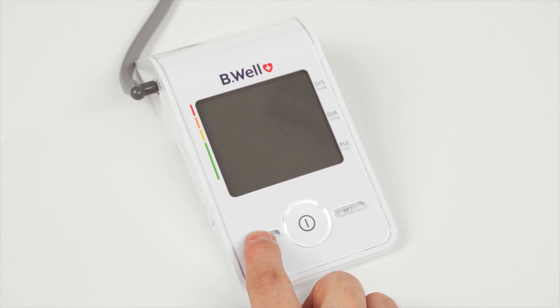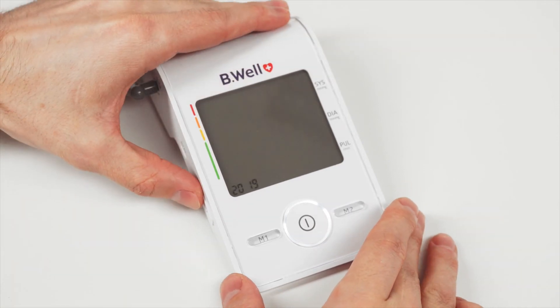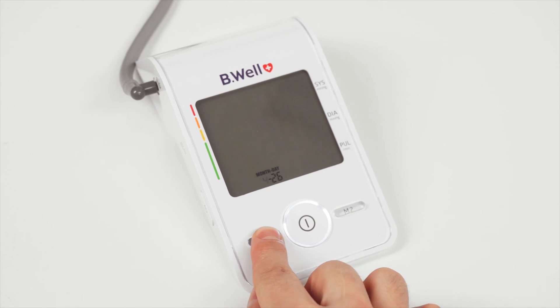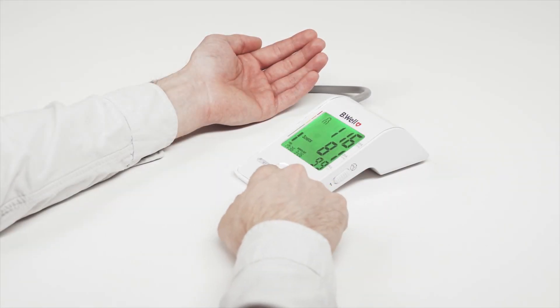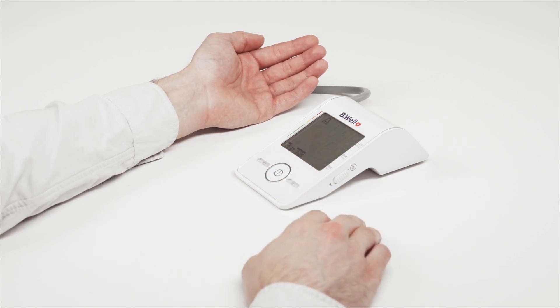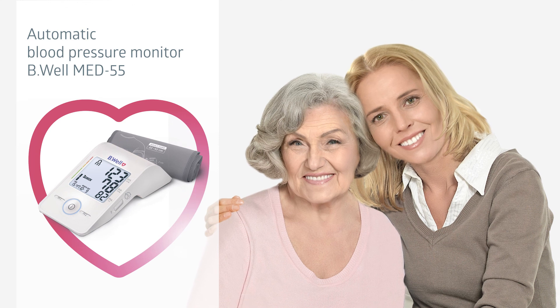If the M1 button is pressed, the value is increased; if M2 is pressed, the value is decreased. Fix the set values with the time button, then turn off the device by pressing the start button. The device will turn off automatically when not used for one minute. Be Well guarantees quality and a high level of maintenance service. You can always consult our specialists and purchase required accessories. Be Well — caring for everyone.